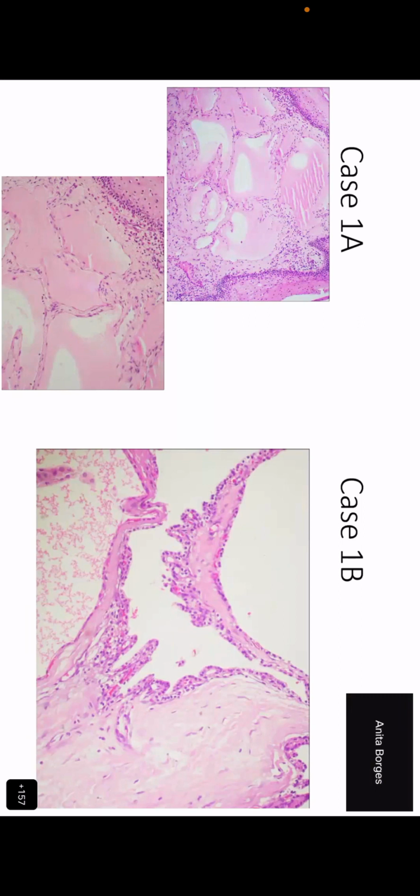No, ma'am. So there is some confusion going on, okay? When we see these dilated spaces, they are essentially sitting in a stroma. Do you realize that, Sumita? Yes, ma'am. They are flattened and contain some pale material inside. It's unlikely that these are epithelial spaces.